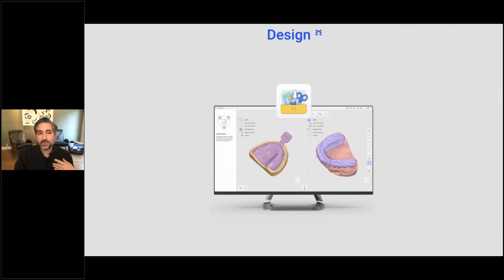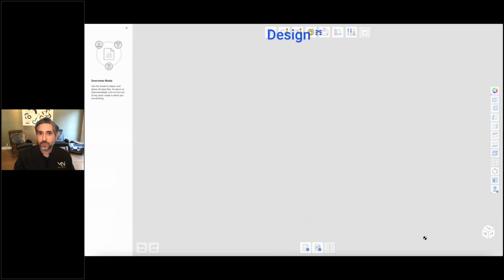And then I said, let's do the design during the appointment. So while he's waiting there, after the scan, we put topical on, I went in to numb him, let it kick in, but I went and I quickly did the design with my goal to have a design made before we start the procedure.